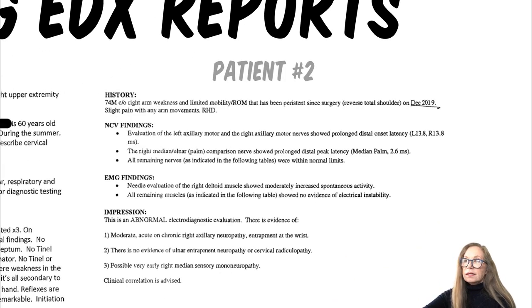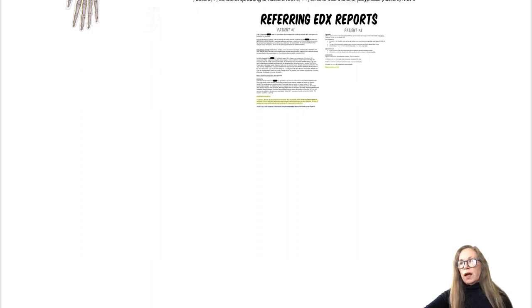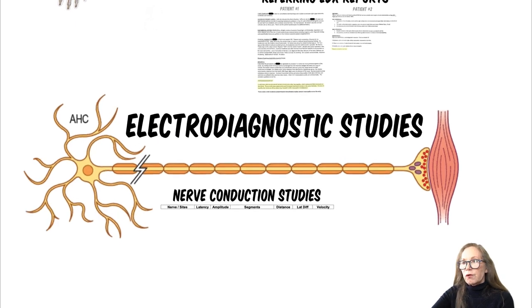However, more typically, this is the result you get from the electrical studies. They summarize the situation, and then they tell you that clinical correlation is advised. So it really is helpful if you know how to interpret the studies yourself in order to come up with an understanding of the type of injury, whether it's going to get better or not, importantly, whether or not the muscles are receptive for nerve reconstruction. And so here we go on the electrodiagnostic studies. There are 2 parts. There's the nerve conduction study and the electromyography.